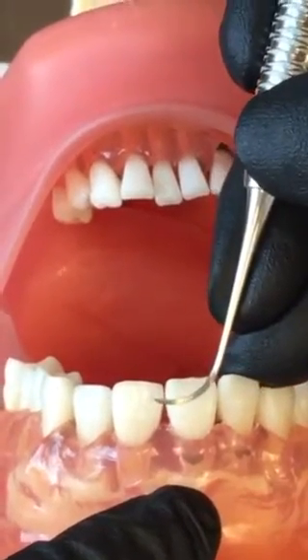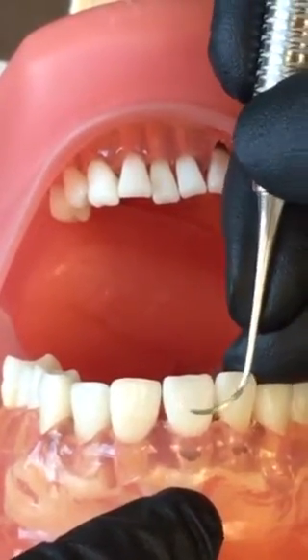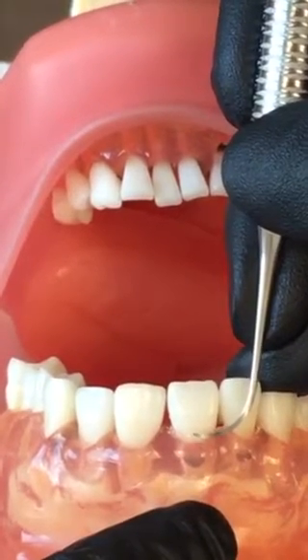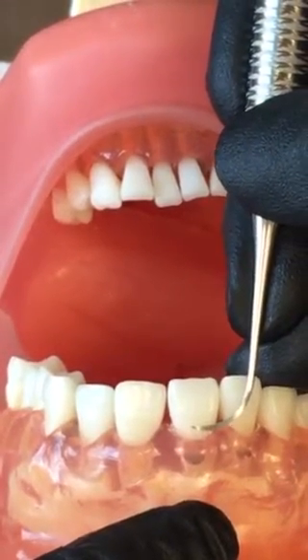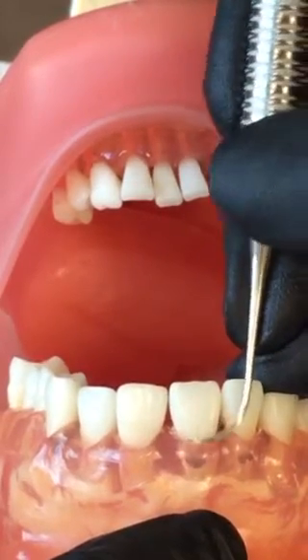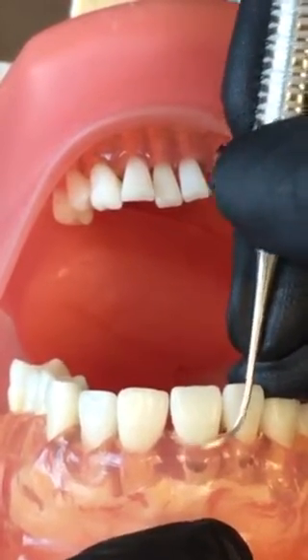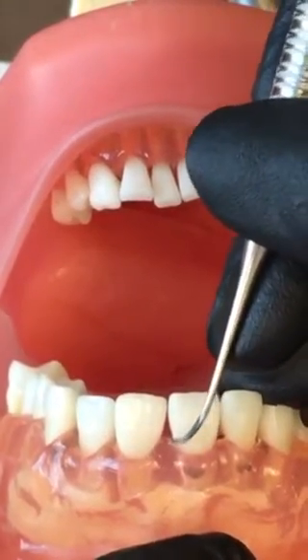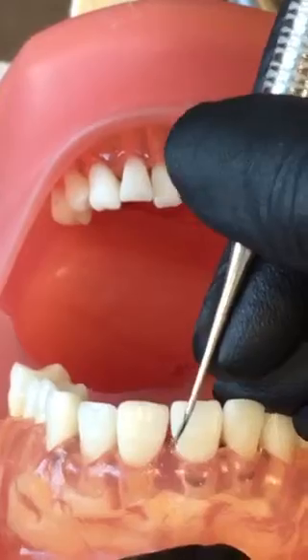We're going to start fulcruming palm up, going to start midline, engaging the lower two millimeters of my instrument, establishing my 70-degree angulation. Use short overlapping strokes, and then roll interproximal.